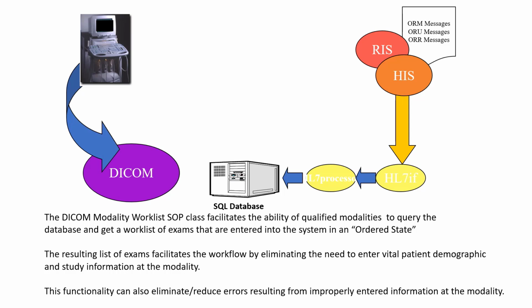The operator or radiographer then performs the examination. When the exam is completed, it moves the data to the radiologist's work list for radiology analysis and a reading.